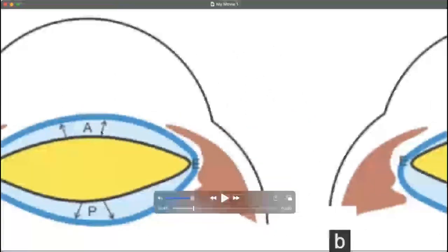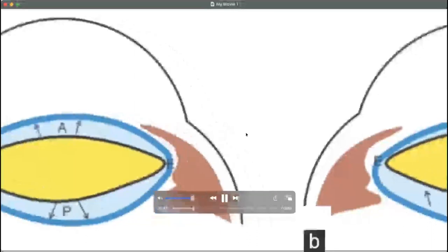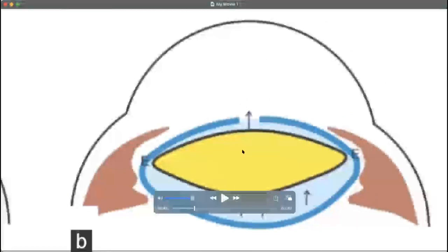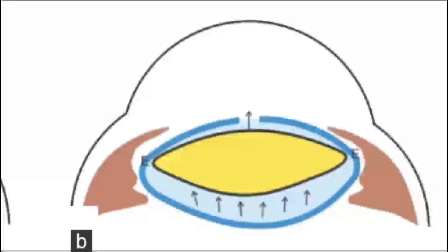Like you can see here, this is the lens, and this is the anterior intralenticular pressure and the posterior intralenticular pressure, which are held apart by E, the equatorial block. When you make a nick in the anterior capsule, the posterior intralenticular pressure is still there, and it pushes the lens upward, thereby expanding the rhexis. This is the reason behind the Argentinian flag sign.